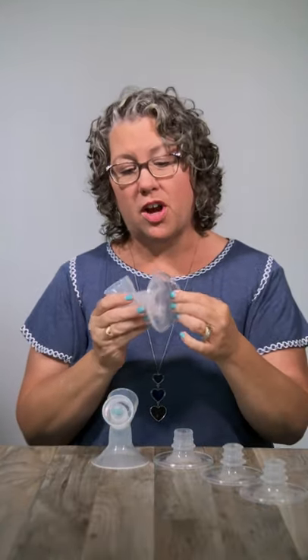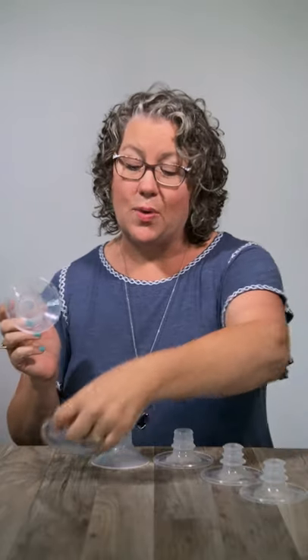But let's say that your nipple is rubbing on the edges. In that case, you want to go up a size. We sell a separate flange that is larger that comes with an insert to give you two more sizes going up.